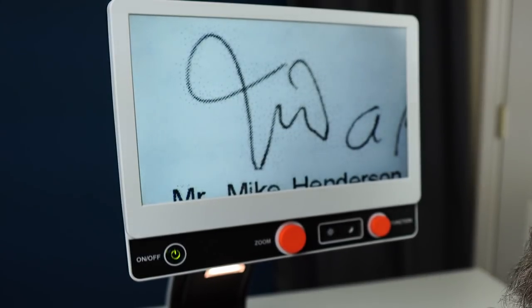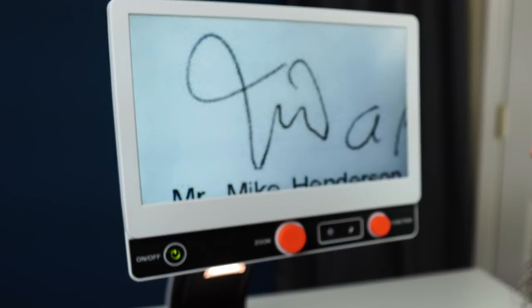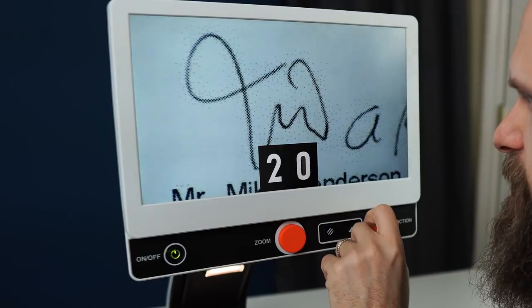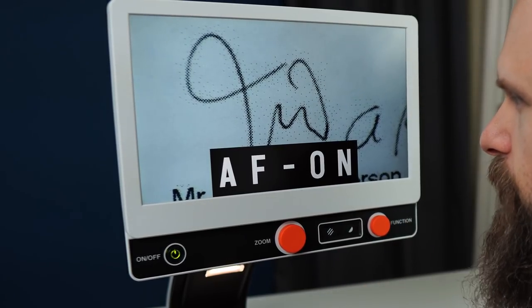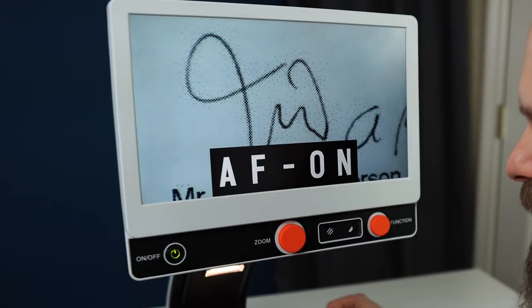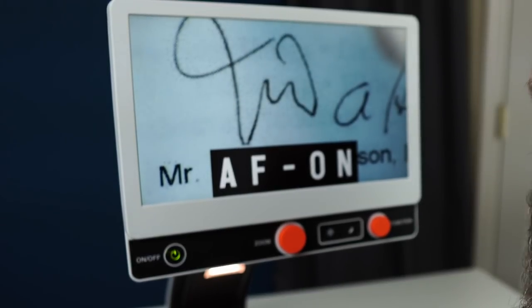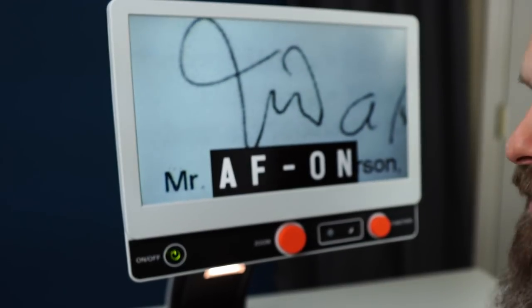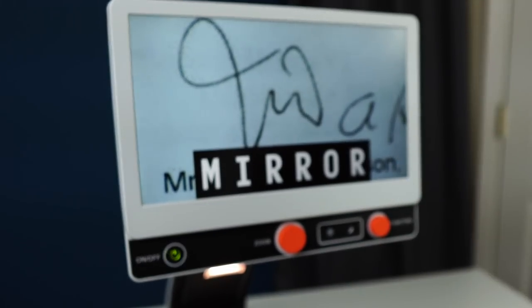Finally, the button all the way to the right is a function dial. This will cycle through all the different functions and the menu of this device — and this thing can do a lot, guys; it's not just magnification. Right now we've got it set to brightness. If I click the button we get into our menu. You can turn on or off autofocus, which is great because if you're writing underneath here, the camera might try to focus on your hand instead of the document.